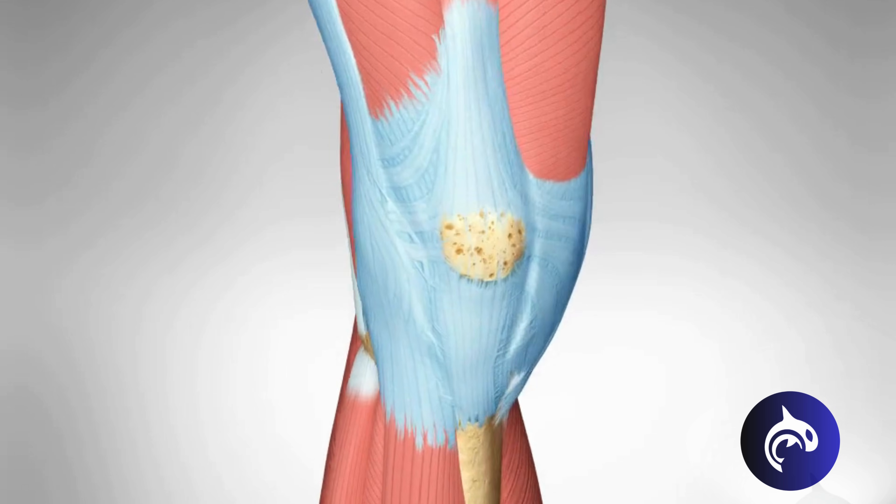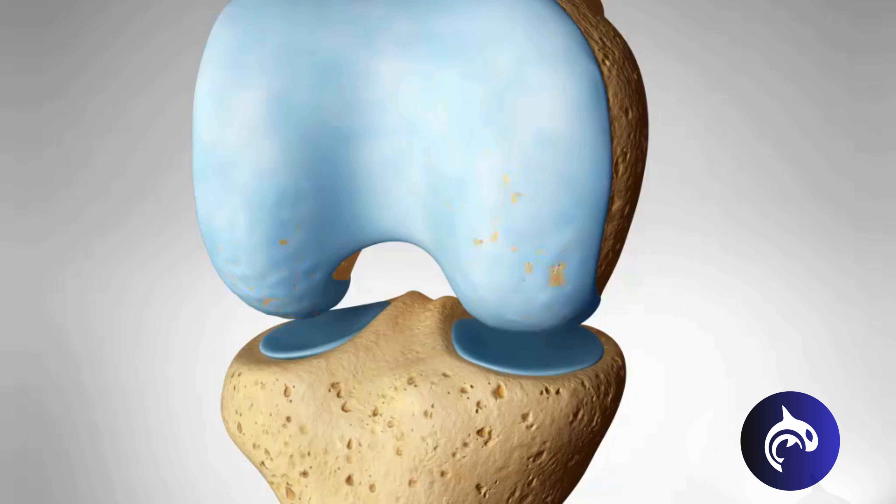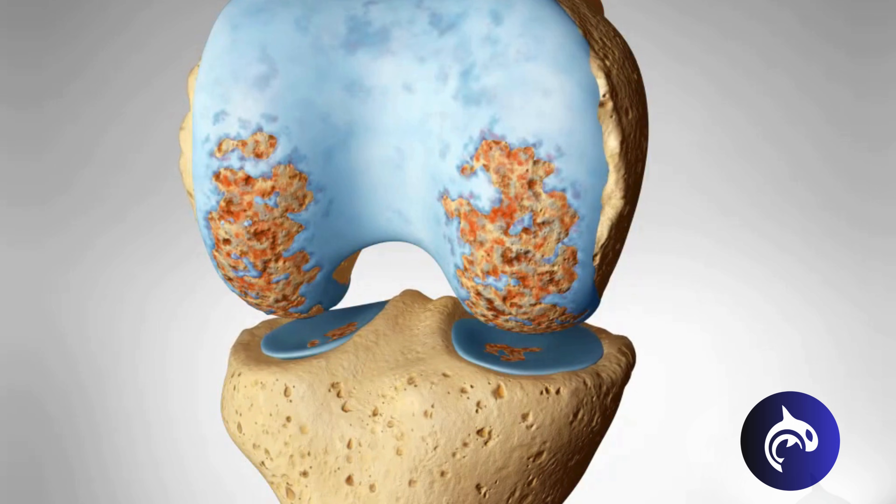A total knee replacement replaces damaged or worn out surfaces of the knee joint with parts made of metal and plastic.